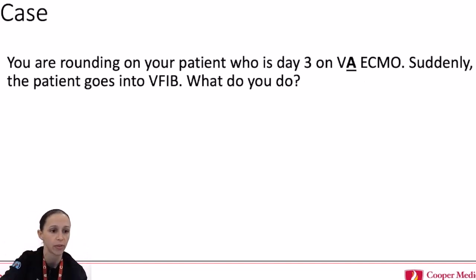So you might have to turn down flow in 500 increments in order to not have loss of pressure just from the chest compressions themselves. But you need to perfuse, and you want to oxygenate your blood too. This would be another time to turn up the ventilator to 100%. In order to perfuse, you have to do CPR.